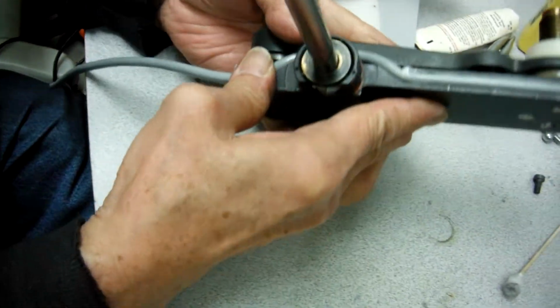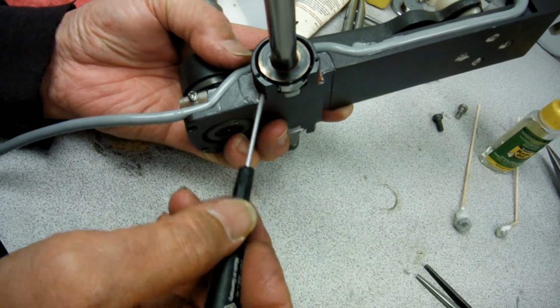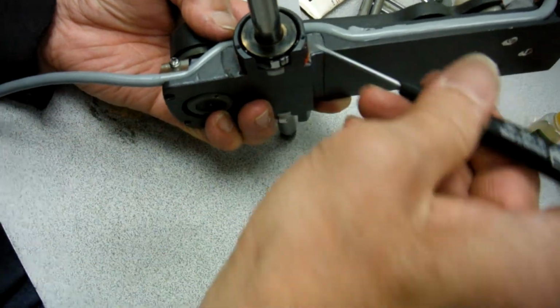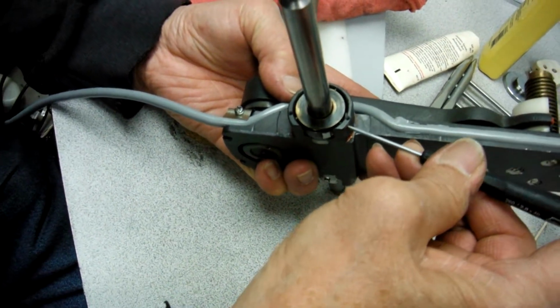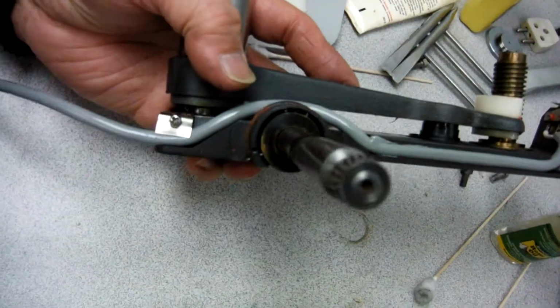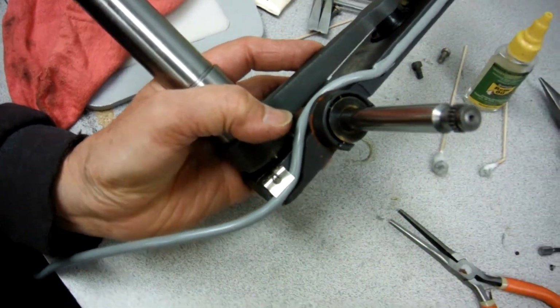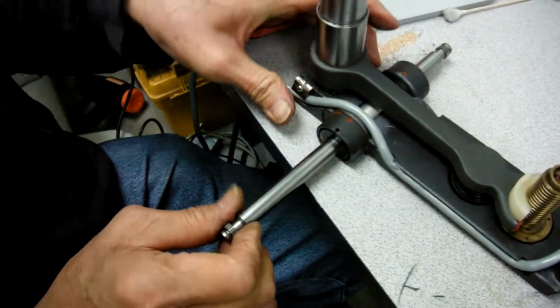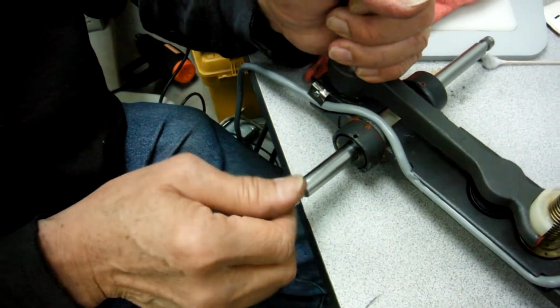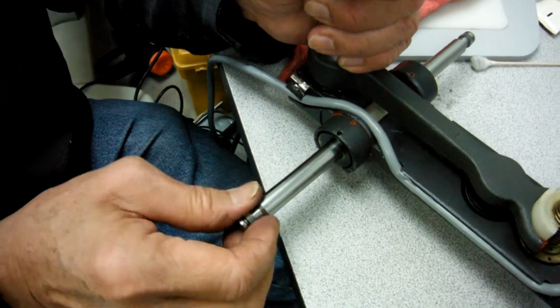If up on the top right here is more than the bottom, then you need to release the two screws down so they can come down. So turn them out, and you make sure you do it evenly, so now you can look at inside there, it's all around, it's just about the same, and that's how you adjust it. Okay, and the correct way is when you adjust correctly, when you spin the shaft in there, you don't see any binding or anything. You see the shaft move inside of that piece.